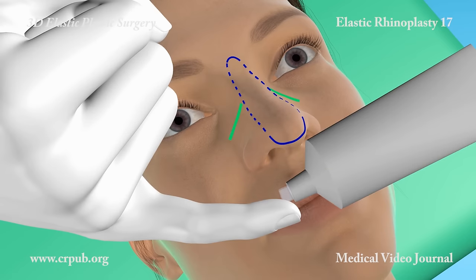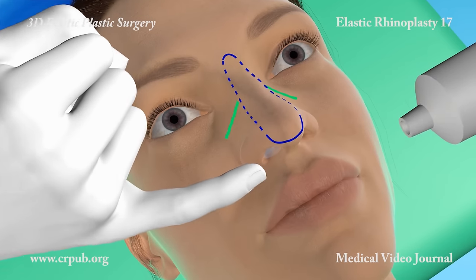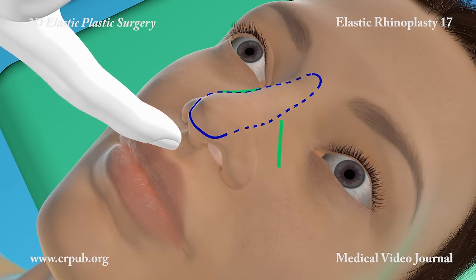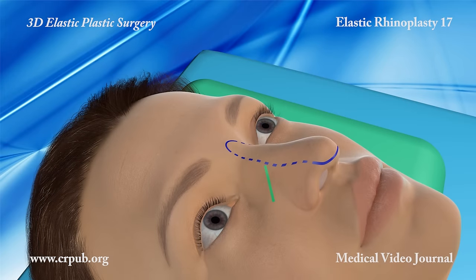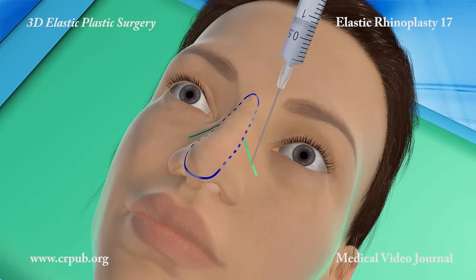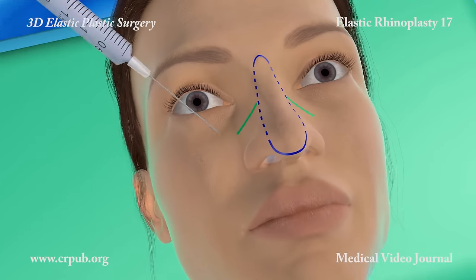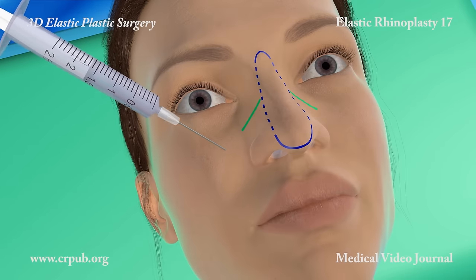An anti-staphylococcal antibiotic ointment is applied inside the nostrils. Local anesthesia is carried out at the base of the nasal pyramid. After anaesthetizing the base of the nasal pyramid, the operator injects the anesthetic along the lower line of the design.